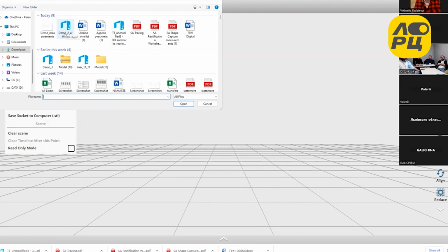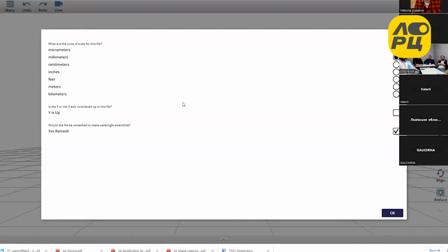So here's the file, so I'm going to click and open.